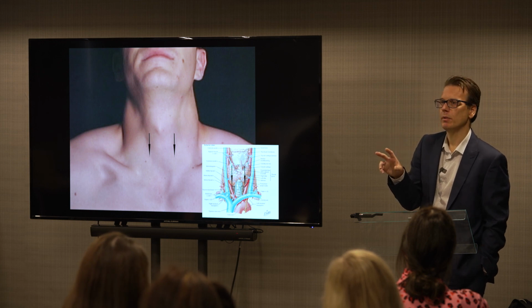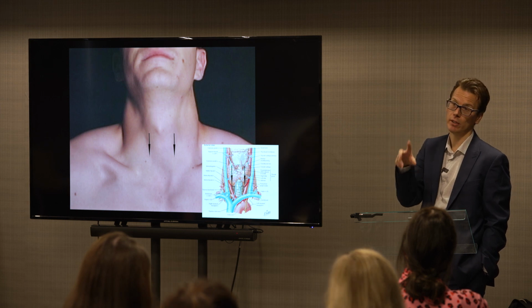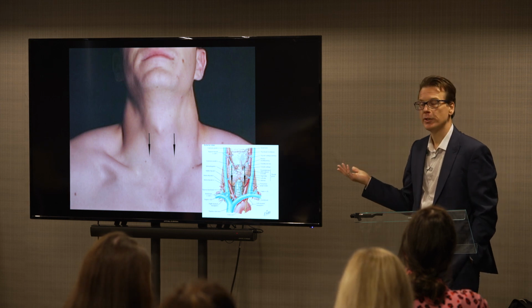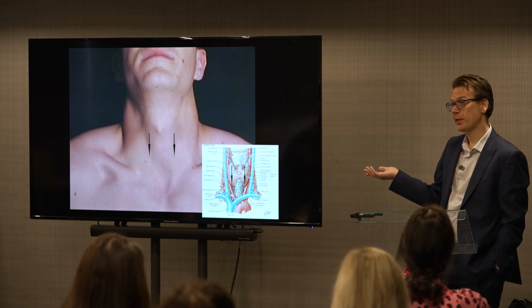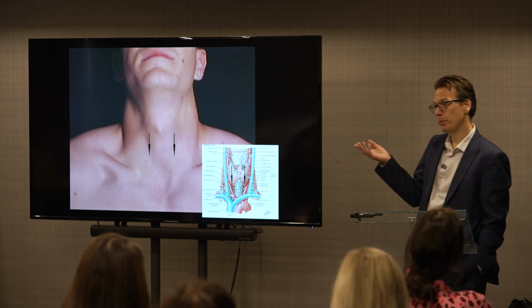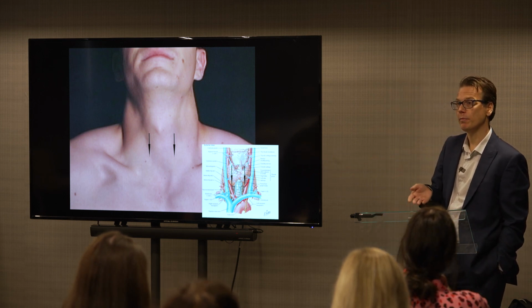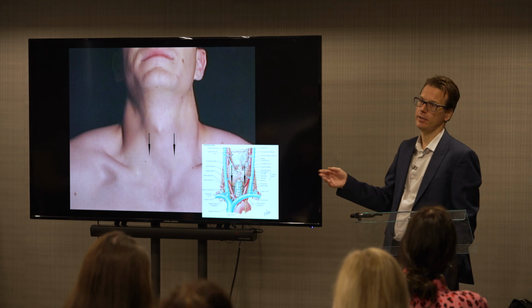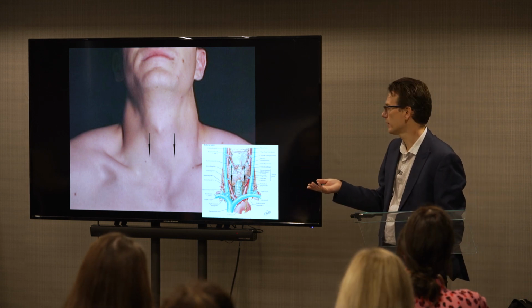Why is that important? If your gain is too high and you can see it flaring outside the walls of the carotid, when you're looking at a thyroid nodule, you can induce central vascularity and that would give you a U3 category. But if you were to calibrate it, that probably would not be there. So it could induce an artifact, and you could give someone the wrong U grade for their thyroid nodule.